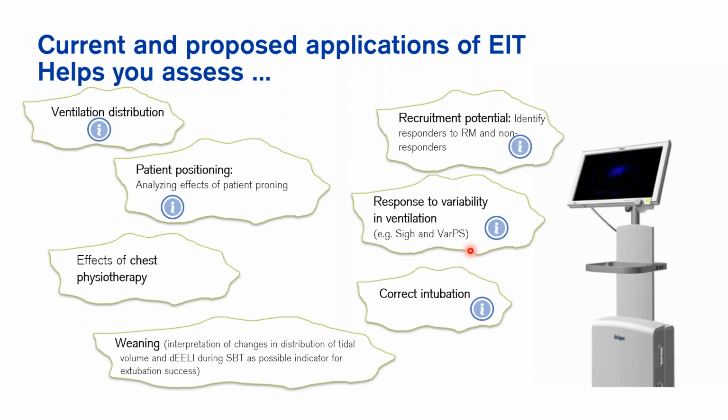Of course, PulmoVista is a great tool to evaluate responders versus non-responders to the recruitment maneuver. We can also look at the response to variability in ventilation. If you're practicing variable pressure support, you can see the response to the variability in ventilation. You can check patient positioning.